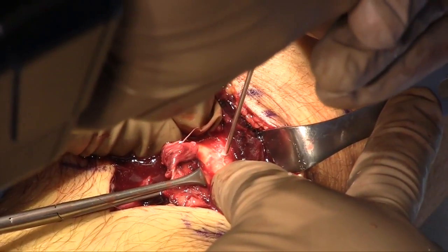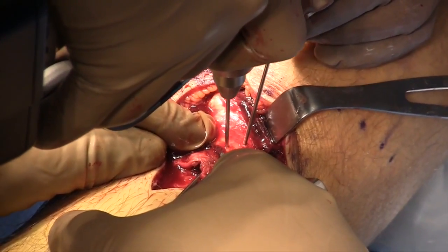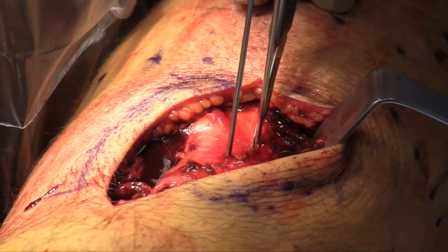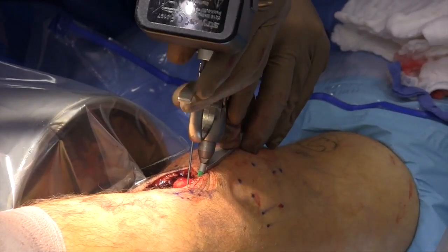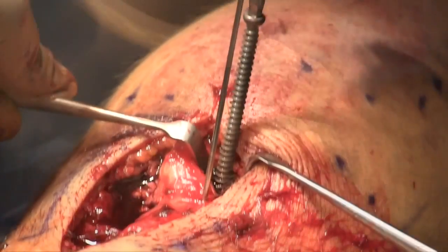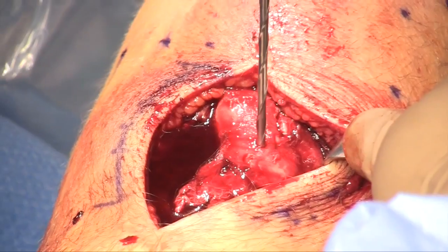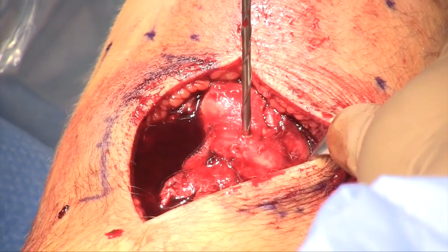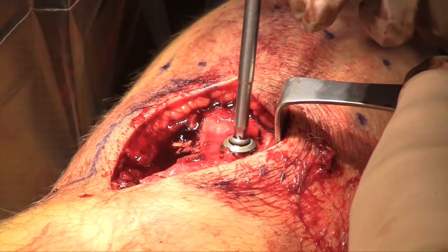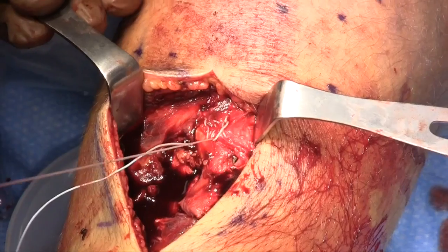The tibial tubercle fragment was then reduced and provisionally fixed using two threaded guide pins. Anatomic reduction was confirmed using intraoperative fluoroscopy. Next, the proximal guide pin was removed and a small vertical incision was made in the patellar tendon, allowing for insertion of the drill guide. The first 4.5 mm cortical screw, which was 58 mm in length, was inserted in lag fashion. Approximately 15 mm distal to the first screw, a second 4.5 mm cortical screw, which was 60 mm in length, and a washer were similarly inserted in lag fashion. Fluoroscopy confirmed an anatomic reduction of the tibial tubercle fracture fragment and appropriate screw length.